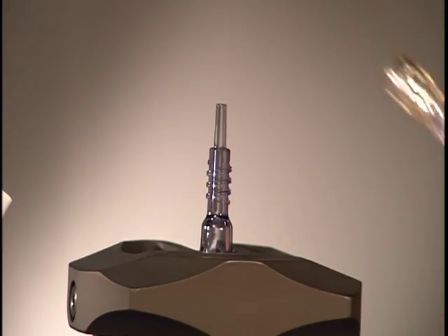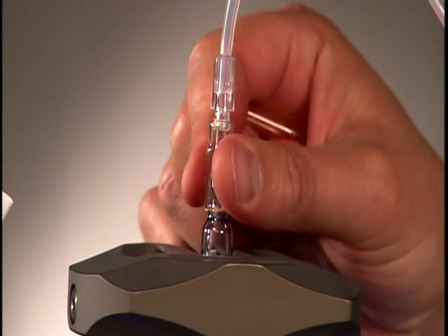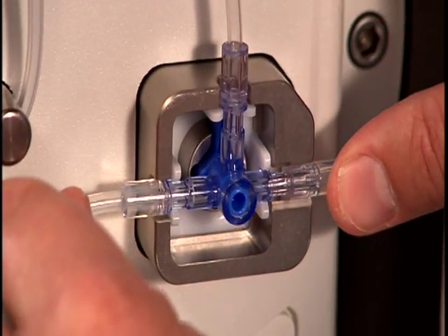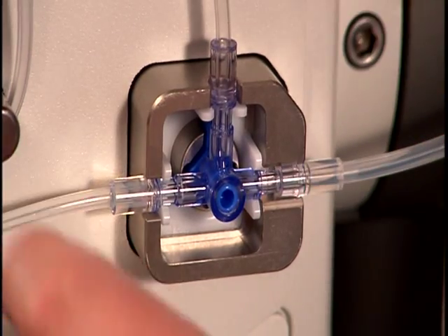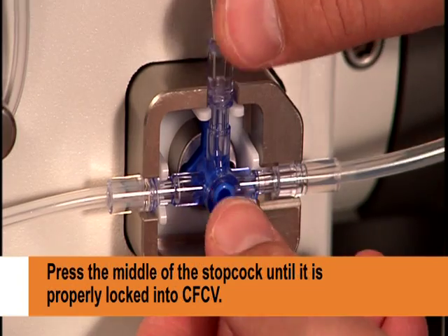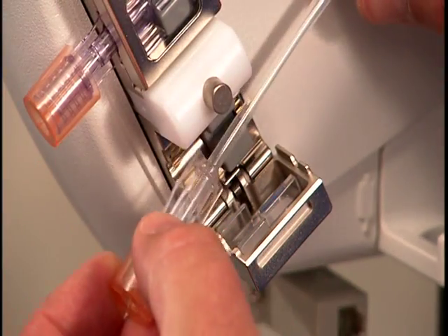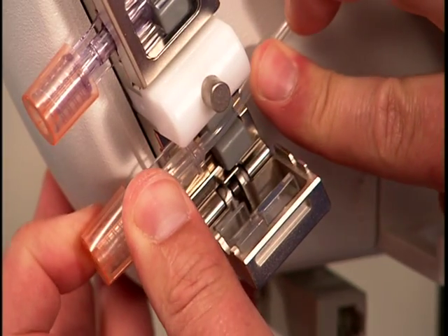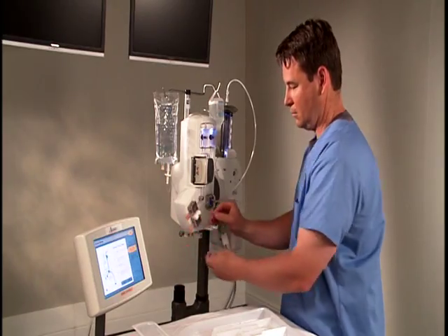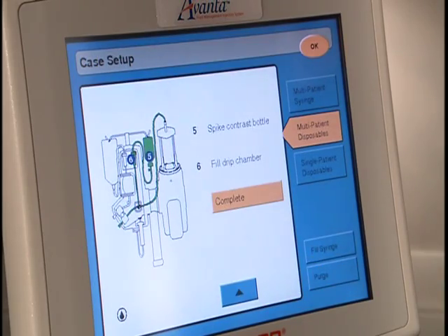Step 2. Connect the tubing to the syringe. Step 3. Install the stopcock into the contrast flow control valve. Press the middle of the stopcock to ensure that it is properly locked into the CFCV. Step 4. Insert the tubing connector into the gross air detector and close the door. Next, touch the down arrow to view the remaining steps.